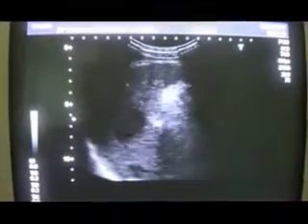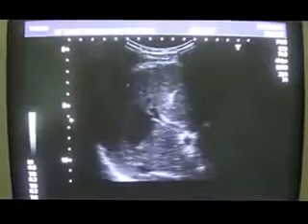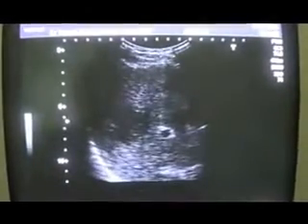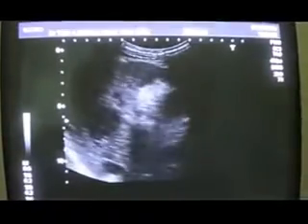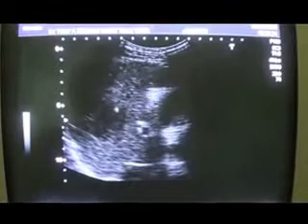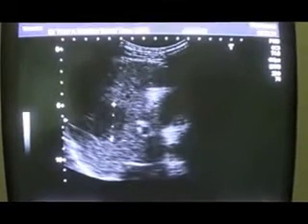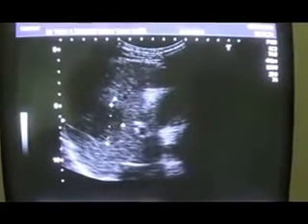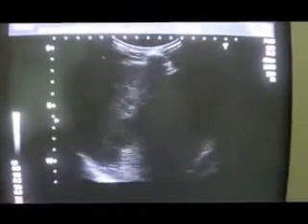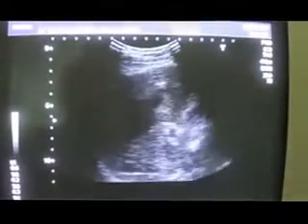And now this, you see there is a hypoechoic area seen in the posterior segment of the right lobe. This one. Now this is the focal area, focal lesion rather I will say. It measures approximately 3.5 centimeter by 3 centimeter, and is in the posterior segment of the right lobe of the liver. Now when I move it, it becomes longitudinal. Just concentrate. Now you see.